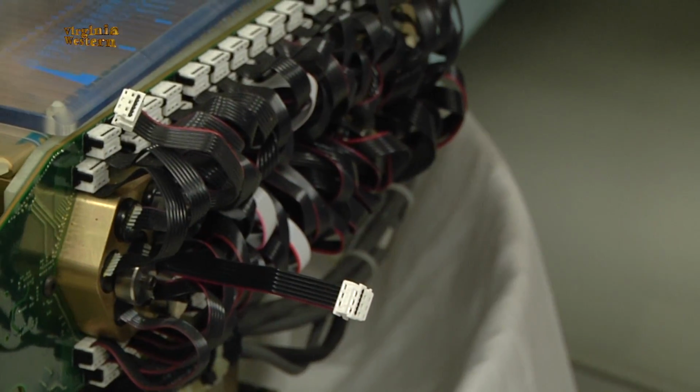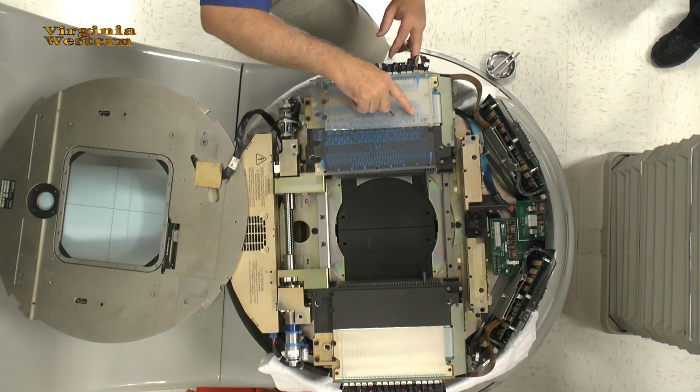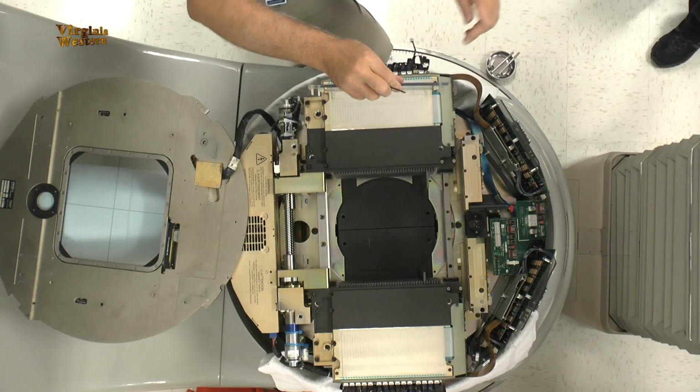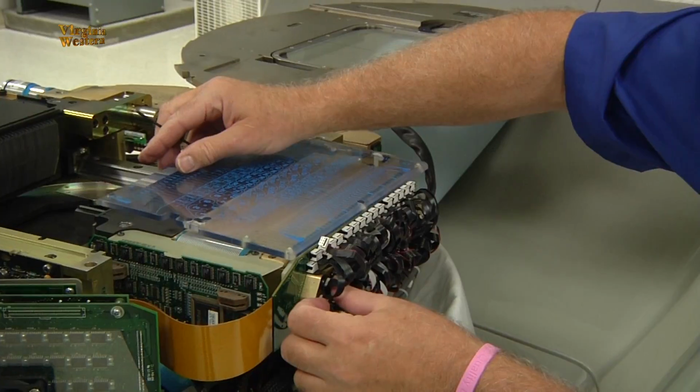So that's where you can look at the clue, and you can follow the wire. I say, okay, this one is motor 4, and 4 gets connected at the lower one. I also have 6 disconnected. That's this top one.